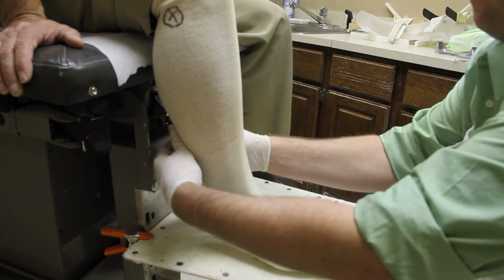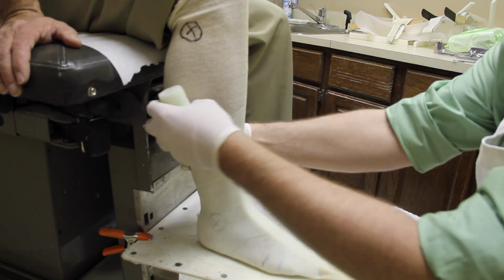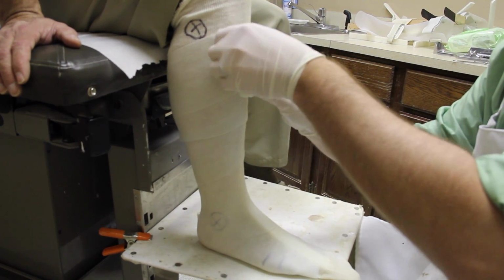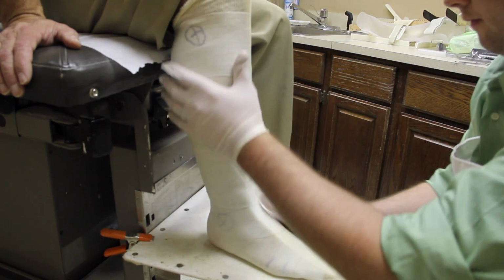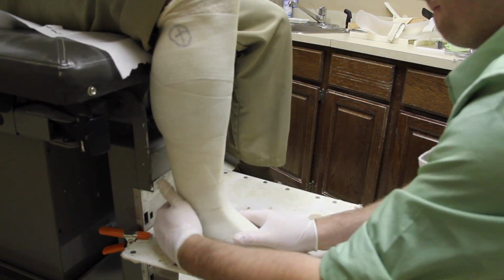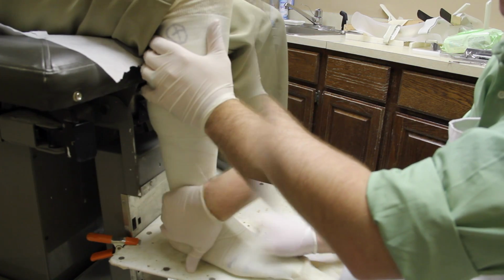Once Derek gets the fiberglass strapped up the leg, then I'll massage the water and the resin together to create a bond so that none of the straps or edges peel apart. Once he gets the fiberglass sealed, it's going to correct my ankle to 90 degrees, and set it in a neutral position and hold it.